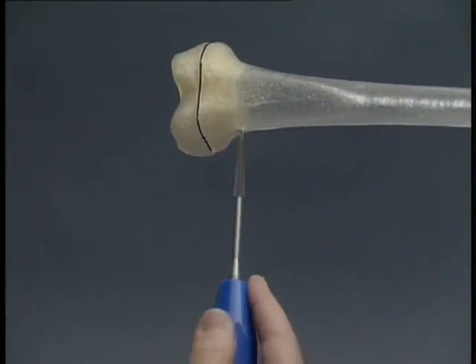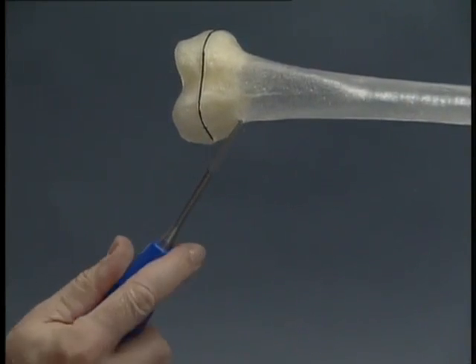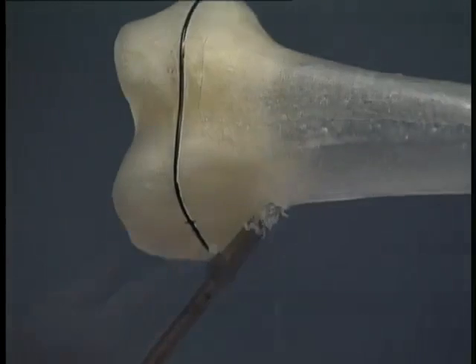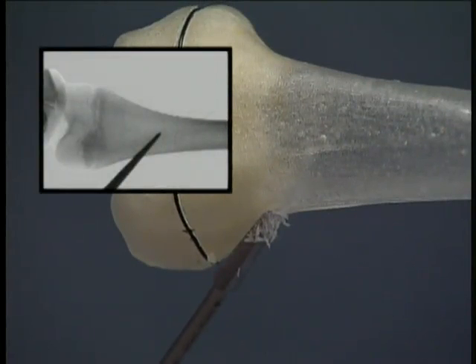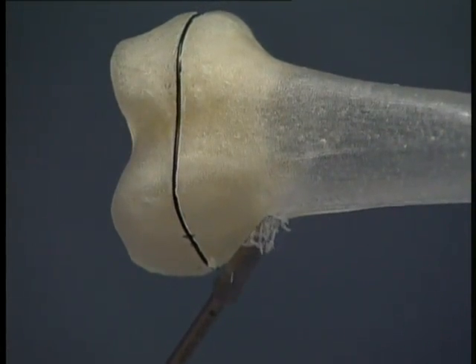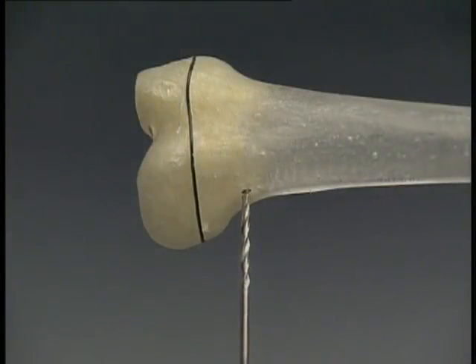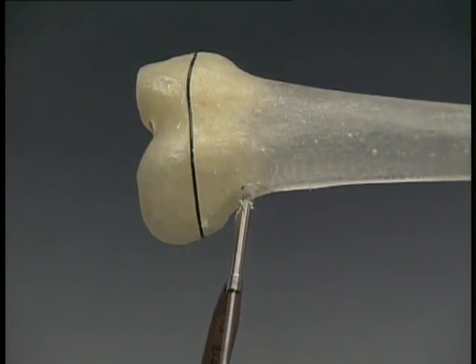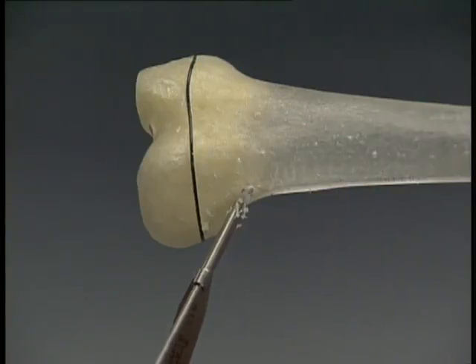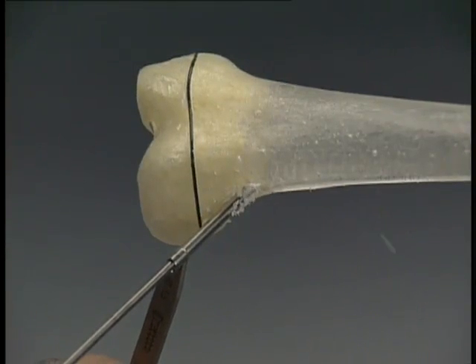The awl is lowered to an angle of 45 degrees in relation to the shaft axis and the perforation of the bone is continued at an upward angle. The position and depth of the awl are checked under the image intensifier. Using an alternative technique, the medullary cavity can be opened with the appropriate drill bit and drill guide. The drill bit may be lowered to 45 degrees only when the drill is running; otherwise the tip could break.